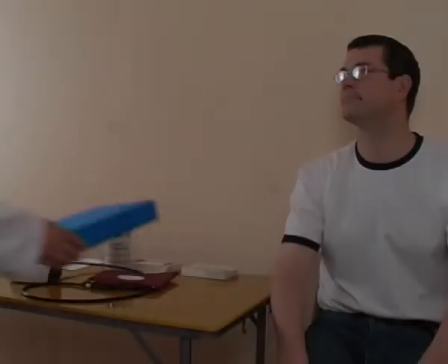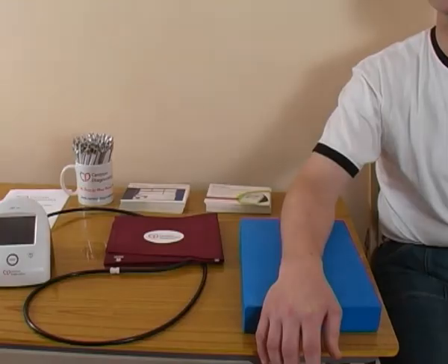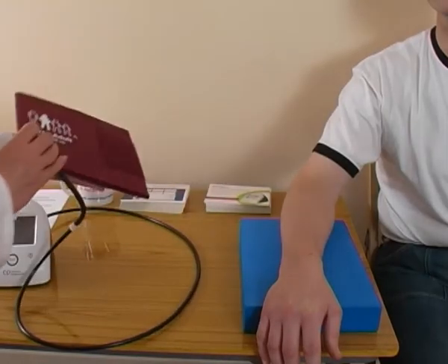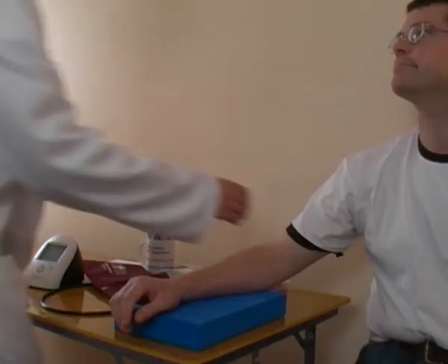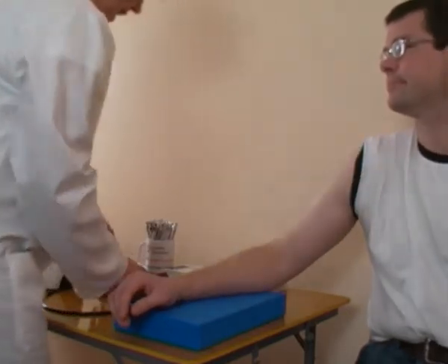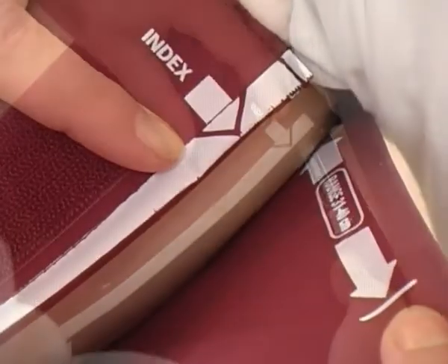It is important to follow the clinical guidelines for the measurement of blood pressure, making sure that the patient is correctly positioned and the right cuff is used. Make sure that the correct sized cuff is used by checking that the index line falls within the range indicator on the cuff.